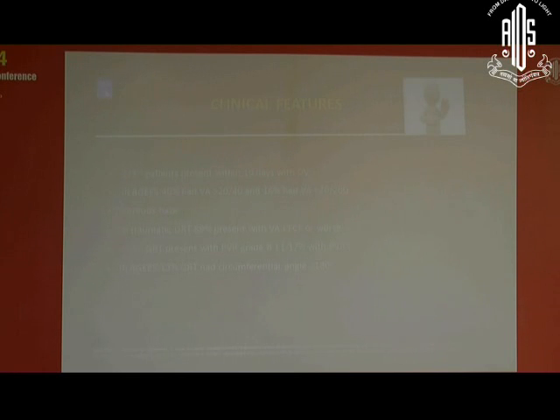I'll just go shortly through the clinical features. Mostly the patients present with dimness of vision within 10 days, and this is important. More than 50% of patients with GRT present with PVR grade B. Now, if you're not able to visualize the fundus, you can do ultrasound, and the characteristic double linear echo can be seen here. So there is absence of retinal echo in at least one quadrant corresponding to the GRT, and you can view the anterior flap by rotating the transducer.